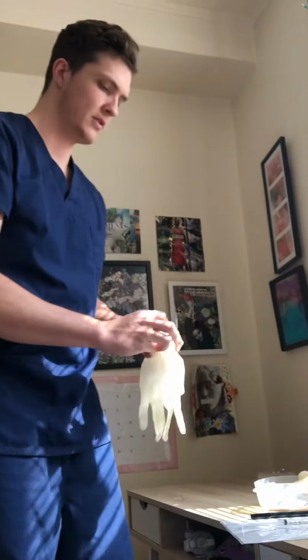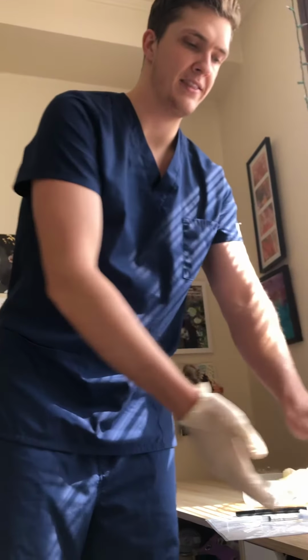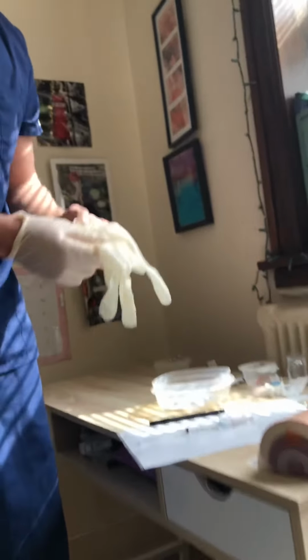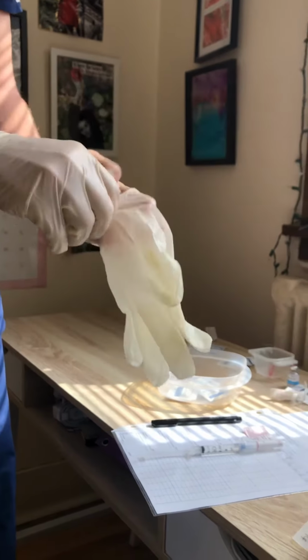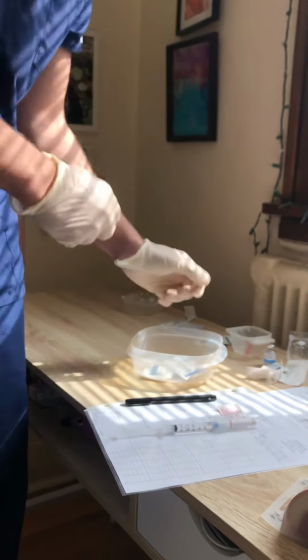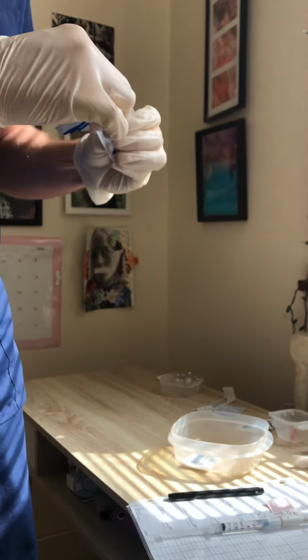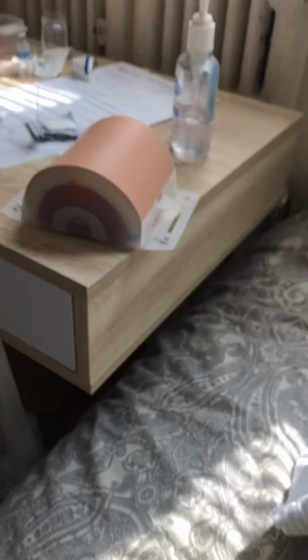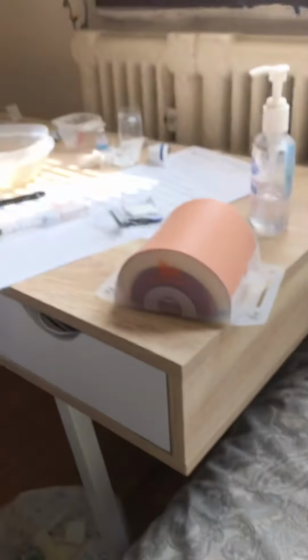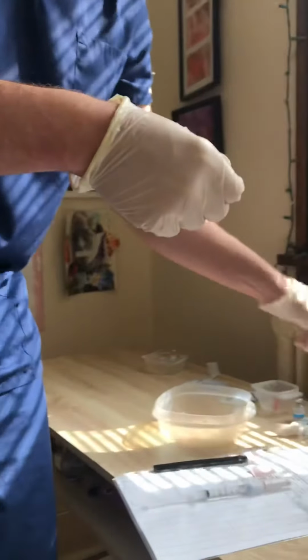So now I'm just going to do hand hygiene. I'm going to put on my gloves. And now we're gonna pretend that this is the vastus lateralis, and I've already landmarked, so get this on the road. My glove is backwards. Okay, so we'll get this open and ready. And I can put that back there on your wrist where it belongs. So now I can just go in the garbage.